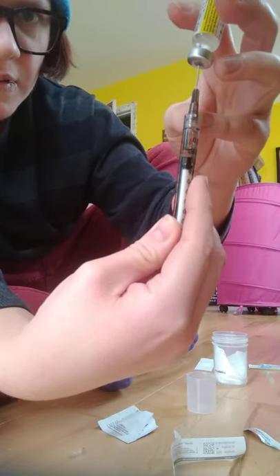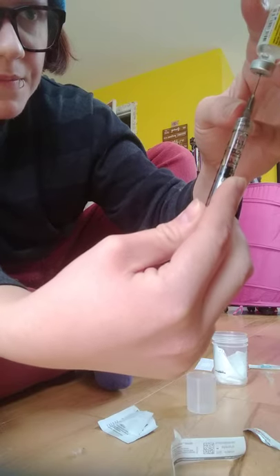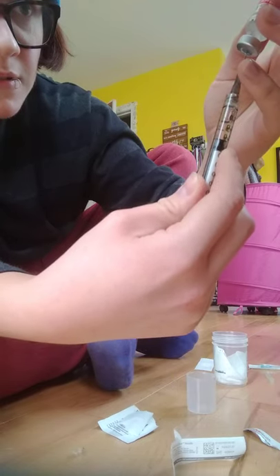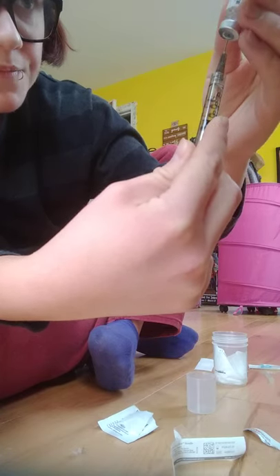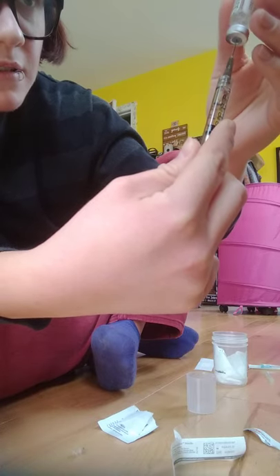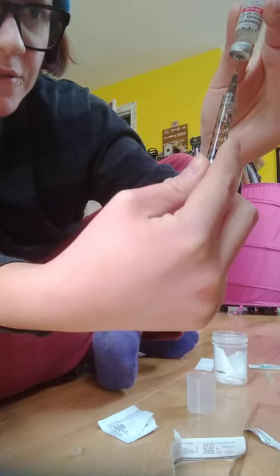You can probably see it building up a little bit. You usually want to draw more than you need so you can expel some later. You'll also have to expel some to get rid of air bubbles — you can flick it to help. It does take a little while; you'll feel like such a medical professional after you do this for a while.